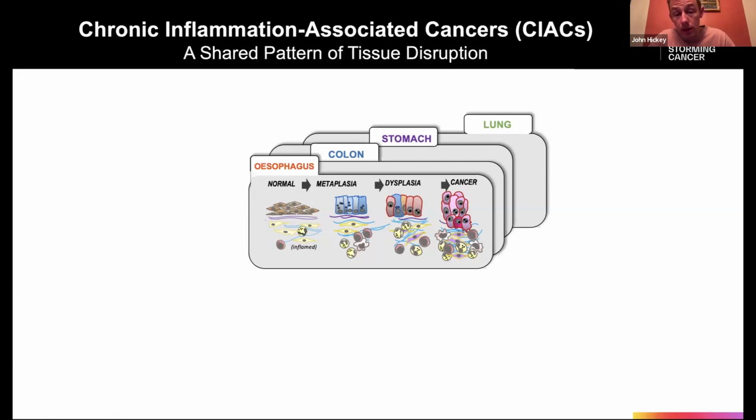Some of these patients then go on to develop what's called dysplasia, which becomes more aggressive. These cells divide much more frequently and don't look very healthy. And then a good portion of these patients go on to develop cancer. It's not entirely clear why this happens and why it's associated with chronic inflammation, but we assume that this chronic inflammation has an impact on the development of the cancer. So we applied our technology to these samples from patients and analyzed them in the same way, looking at these cellular neighborhoods.